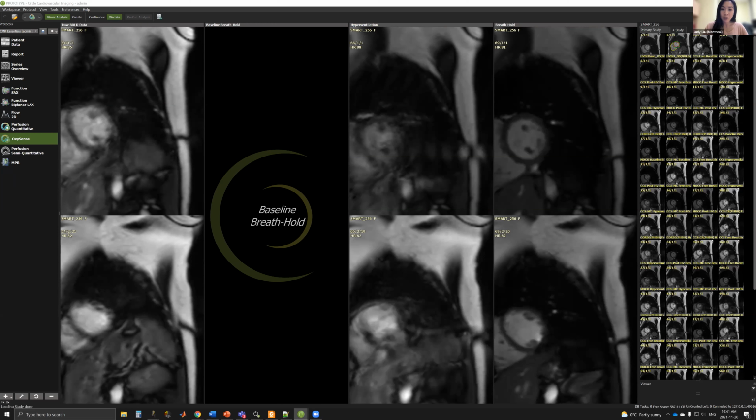Thanks, Mitchell. There's a comment from the audience, from Calder Shigren. Are these calculations happening on the server side, or what kind of hardware is needed for post-processing calculations? This is all on my standalone workstation. Server-side processing is definitely something that's on our roadmap. You can imagine that once the series reaches the server, we have an automated processing that would be triggered. So by the time you're sitting down for a read, all of this analysis would already be done. It is computationally heavy. These processing algorithms are fairly sophisticated and do scale very favorably with more contemporary hardware. But on a server, you usually have a fairly strong machine, so that should be fine for most cases.